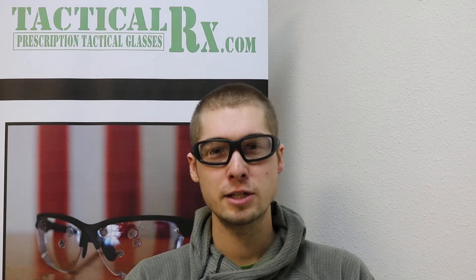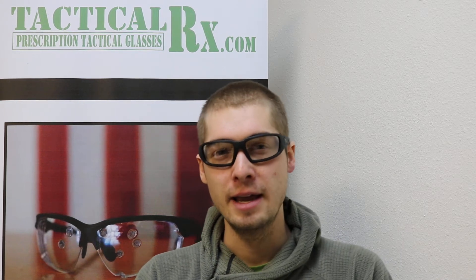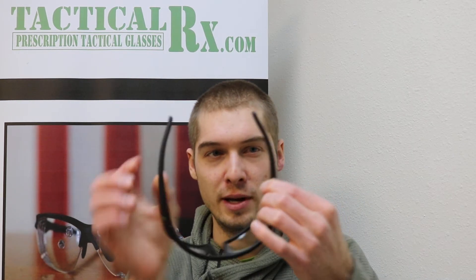Hello, Andrew at TacticalRx, and this is the Little Bear frame. As you can see, it's a wrap-around sports frame. It does provide excellent protection from the side, and one thing that's great about this frame is it's got quite a bit of stretch to it.